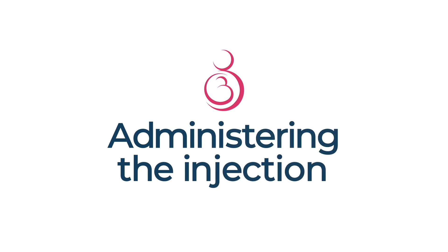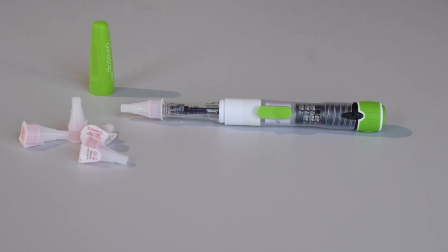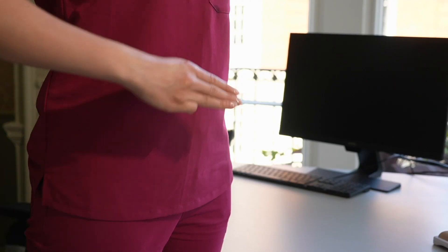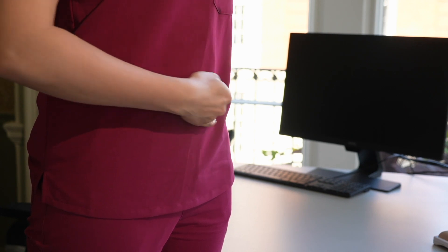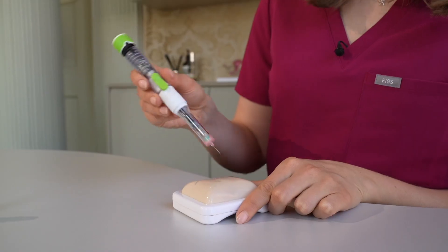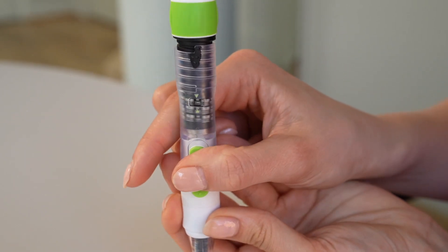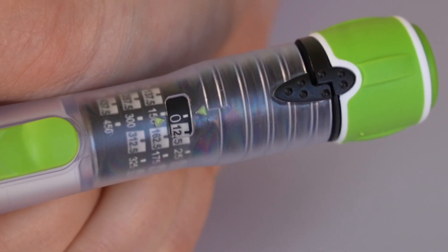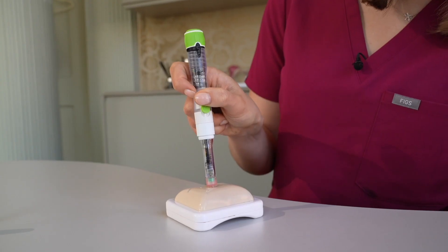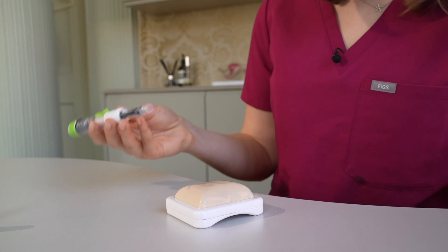Administering the injection. Overleap is a subcutaneous injection and is best administered into your abdomen. Locate the area to inject by placing three fingers below your belly button and pinching the skin in this area. Insert the needle at 90 degrees, push the injection button in the direction of the needle and hold it. Press down until the indicator dose is zero. Hold for a few seconds to allow for absorption, then remove the needle. A small drop of fluid or blood is nothing to worry about.